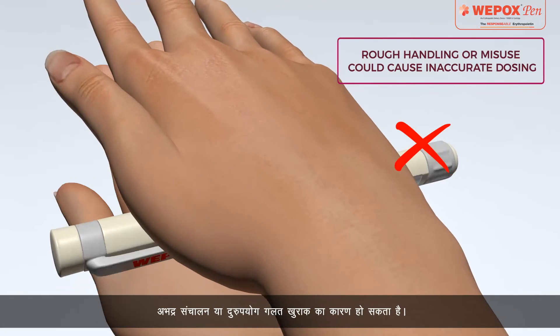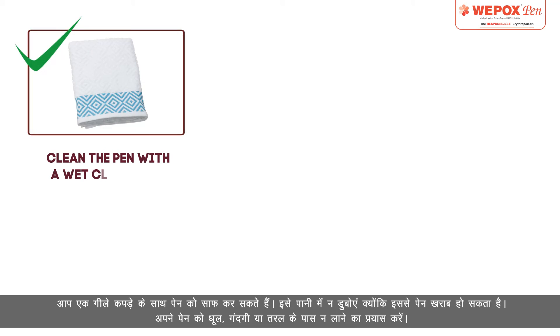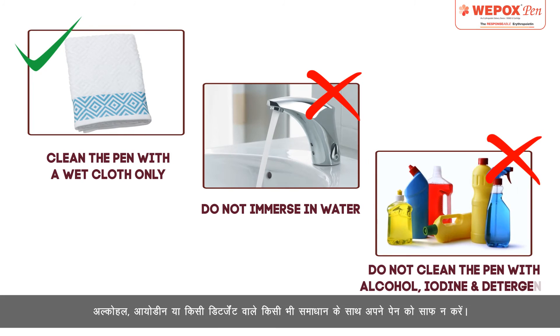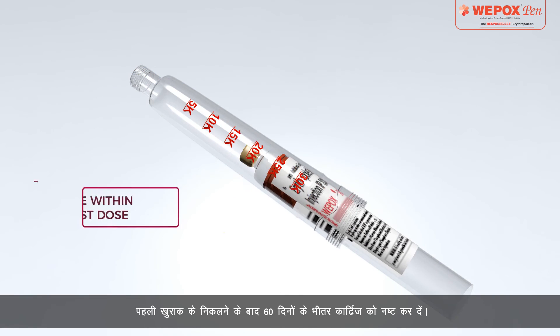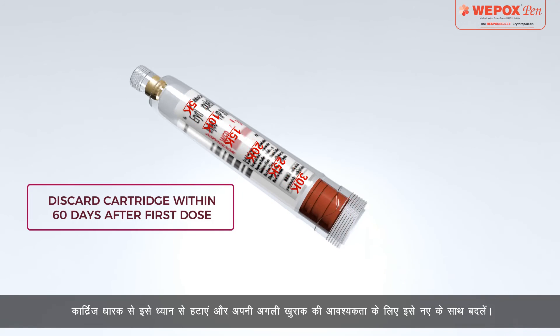Rough handling or misuse could cause inaccurate dosing. You can clean the pen with a wet cloth — do not immerse it in water as it may damage the pen. Try not to expose your pen to dust, dirt, or liquid. Do not clean your pen with any solution containing alcohol, iodine, or any detergent. Discard the cartridge within 60 days after the first dose withdrawal.